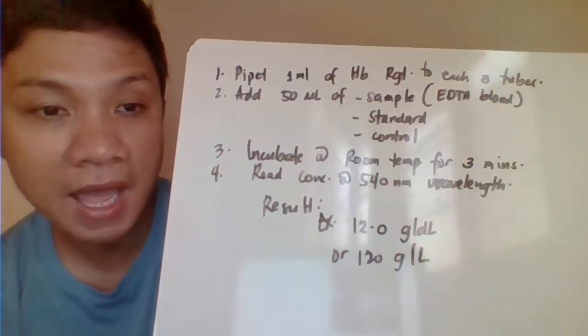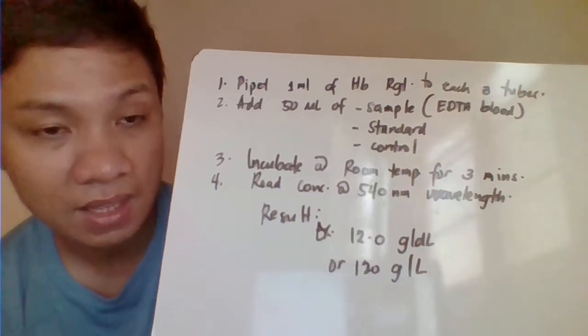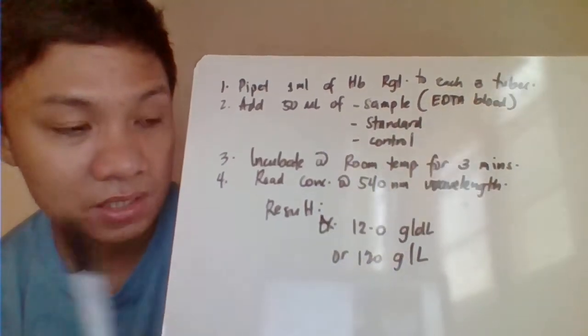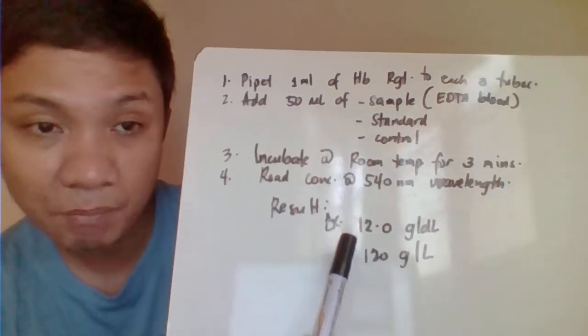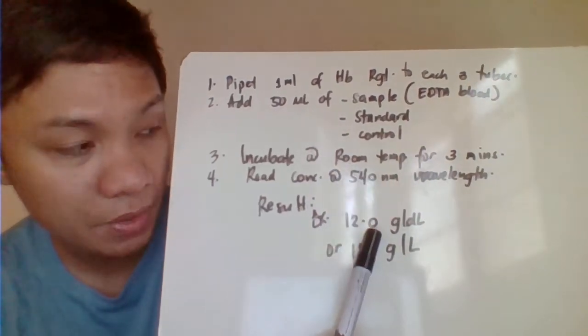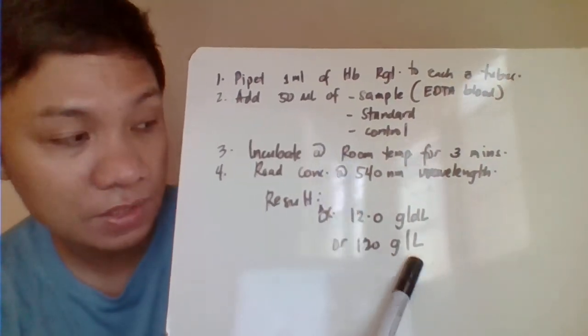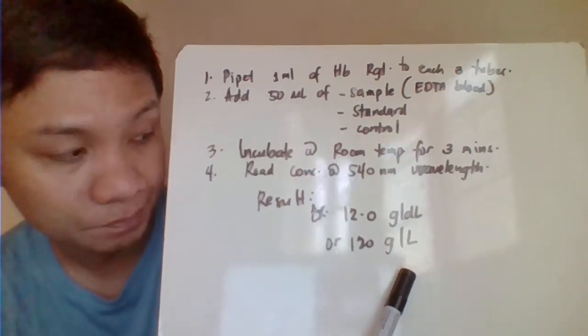Then after 3 minutes, you read at 540 nanometer wavelength. Still the same wavelength. And whatever the result, this is how we report it. If your reporting is 12.0 grams per dL, you can also convert it to grams per liter, just multiply by 10. That gives you 120 grams per liter.